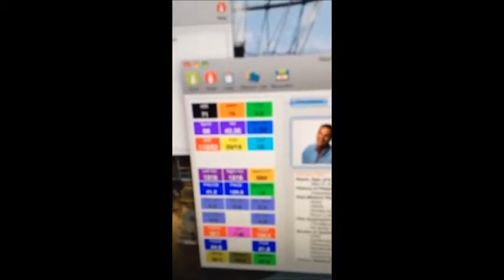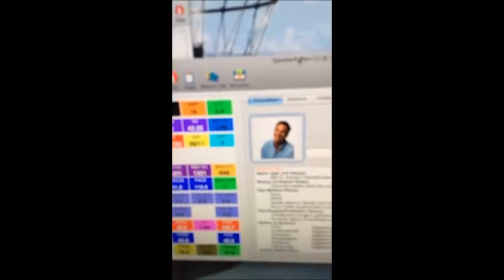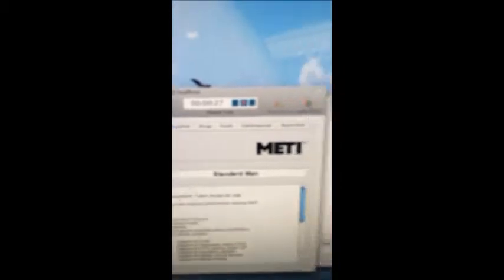Many of his vital signs are here. You can see there's a green box with his respirations and a purple one up here for his SATs and pulse and all sorts of things. So at this point the software is running, and the rack should hopefully have warmed up enough that when we click on connections, this connection box here, we'll see the mannequin available for us to click on. You can double click on this to start it, or you can click on it and click connect, and that connects the software to the mannequin.